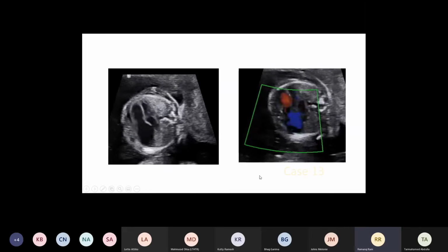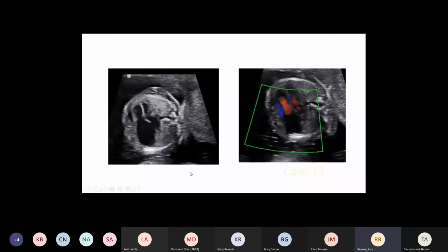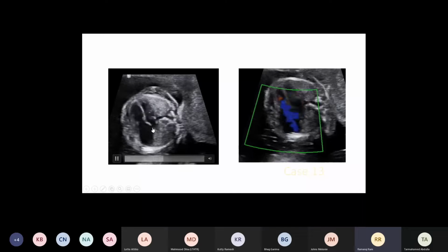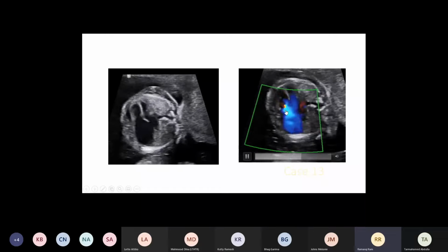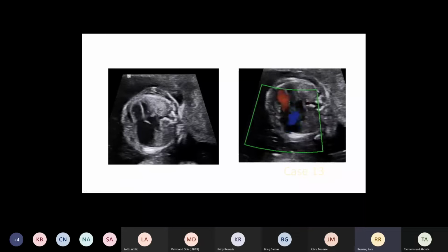So this is another example of a similar right heart abnormality, where you see your offsetting is maintained and your tricuspid valve attachment is maintained, but it's quite a leaky tricuspid valve dysplasia rather than Epstein's here, which is causing a very huge right atrium in this scenario.